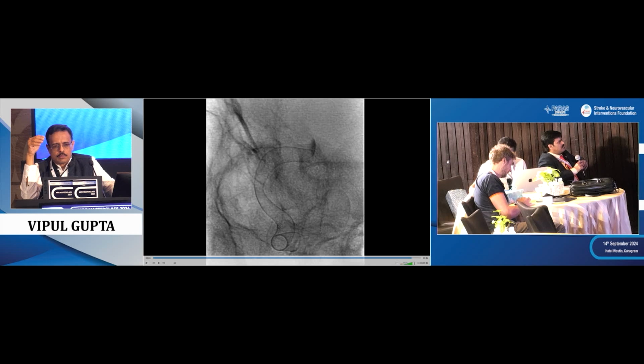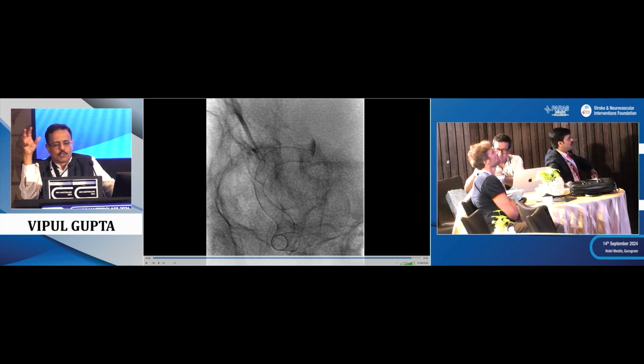And so I mean, Vincent, when do you see this kind of fish mouthing or stent distortion at that lower end? I mean, what are the other situations it can happen?